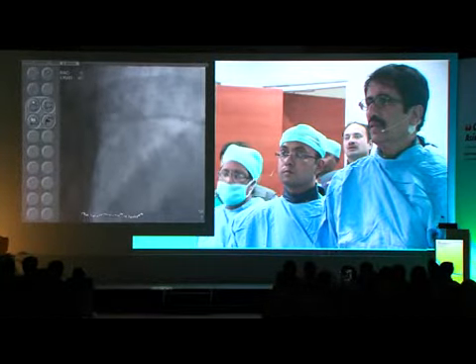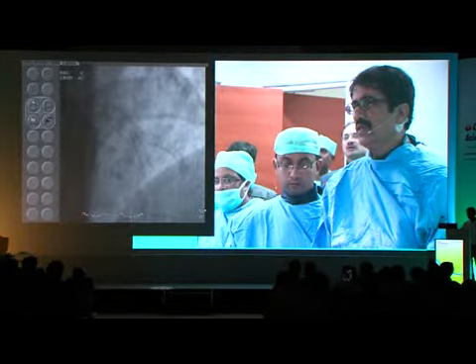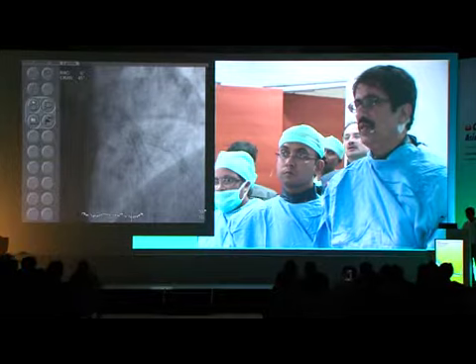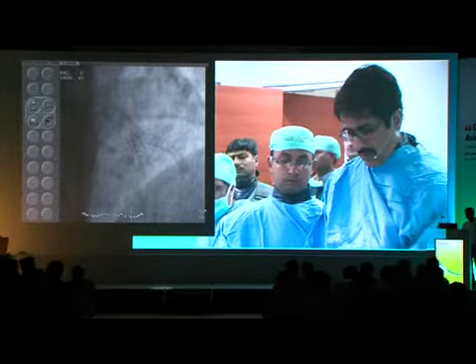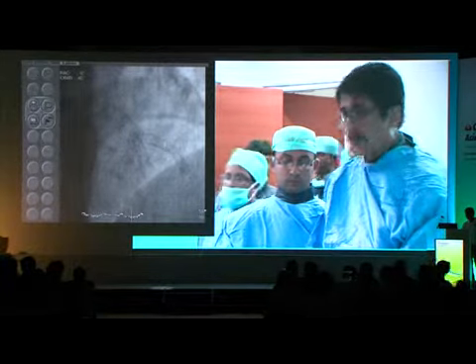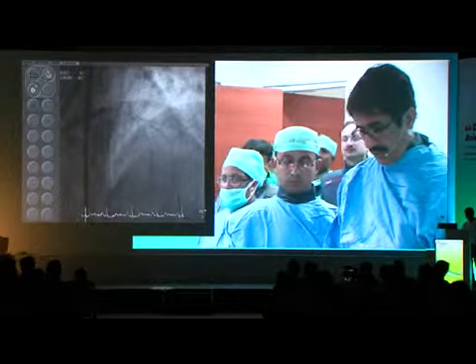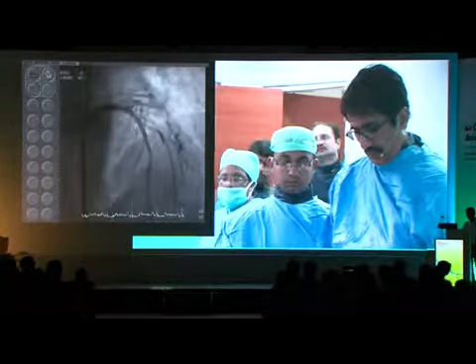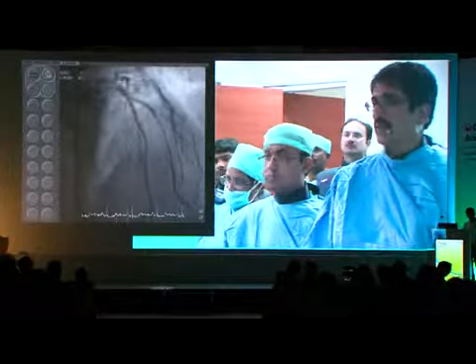See, I feel the stent is very well expanded both here as well as in the zoom. Shirish, I don't think you need to work more on the diagonal, because this is a whole diagonal disease, and it is expected that the lumen will grow gradually, because the proximal thing has been taken care of.